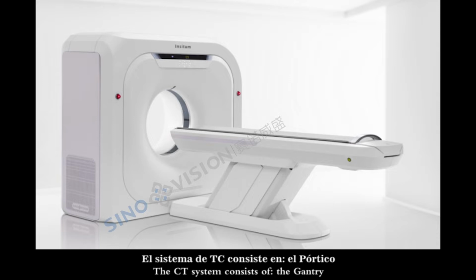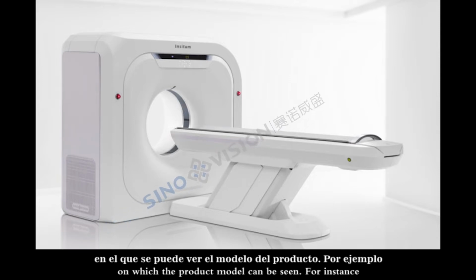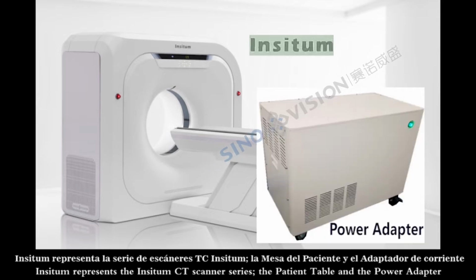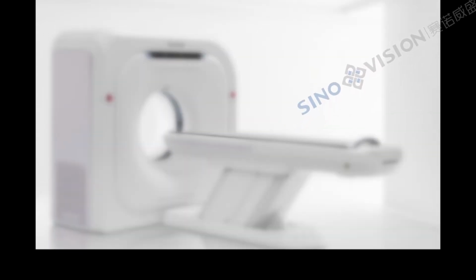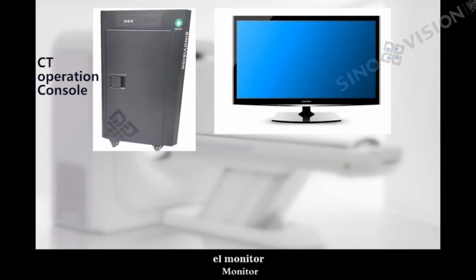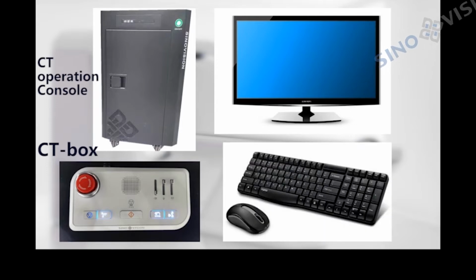The CT system consists of the gantry, on which the product model can be seen. For instance, Insitum represents the Insitum CT scanner series, the patient table and the power adapter. These components are usually placed in the scan room. In the operating room, we can see the CT operation console, monitor, the CT box, the keyboard and mouse.